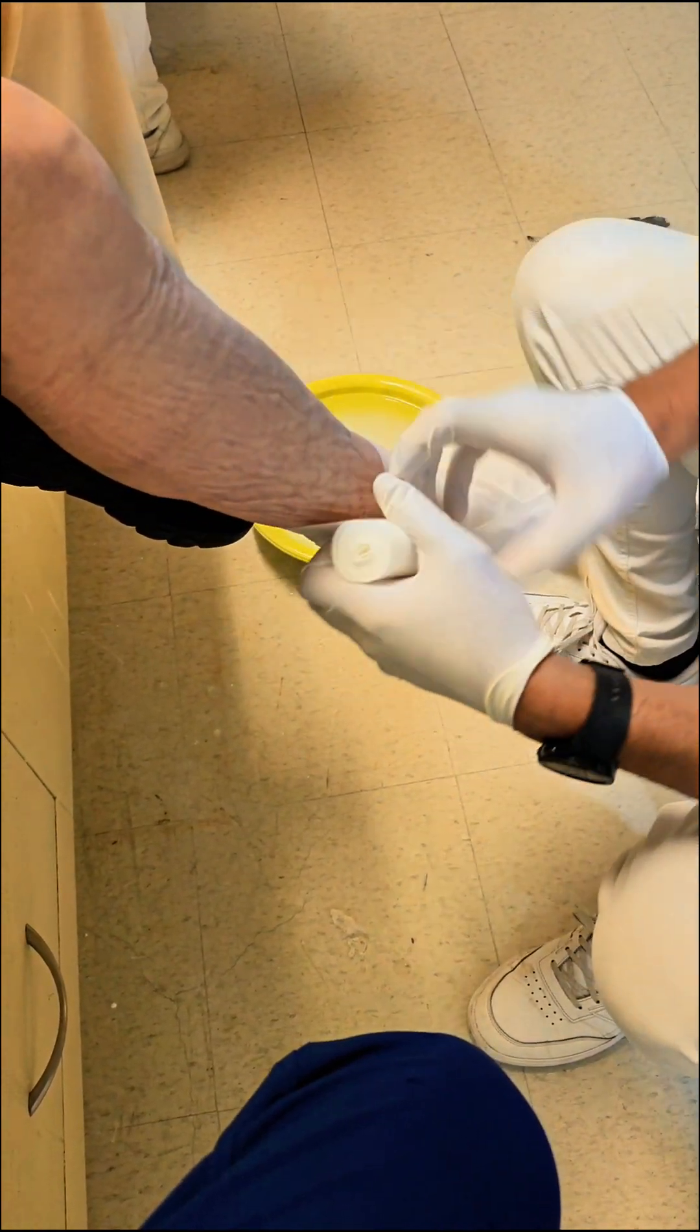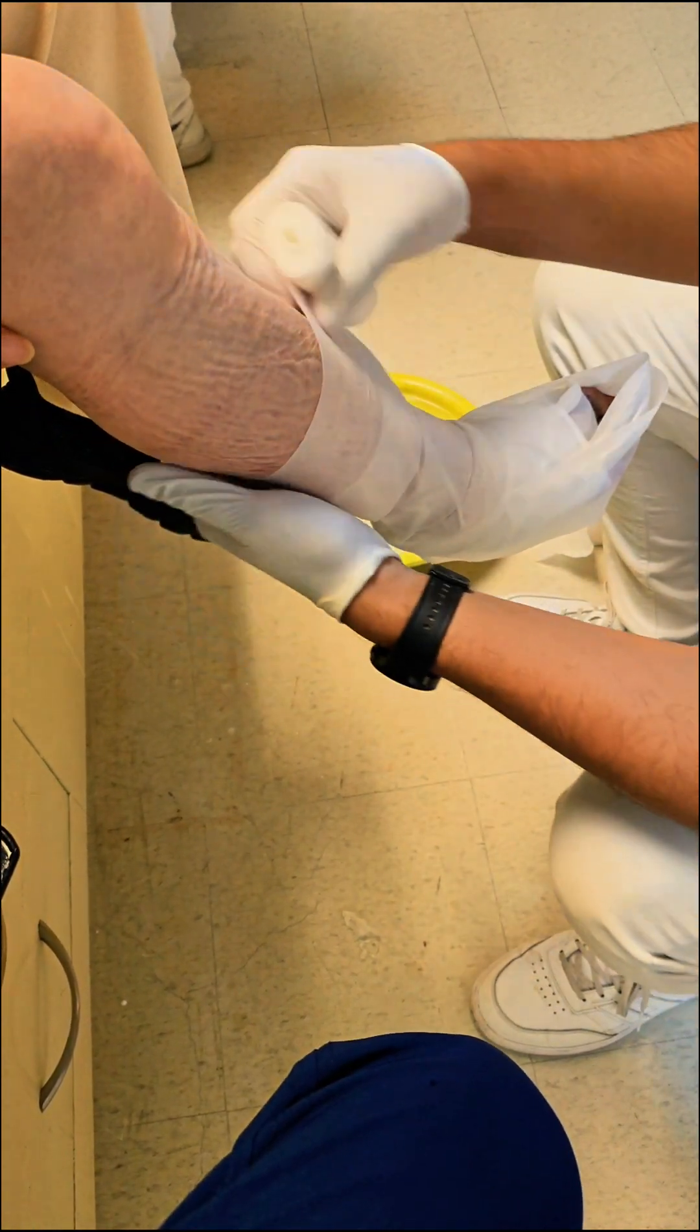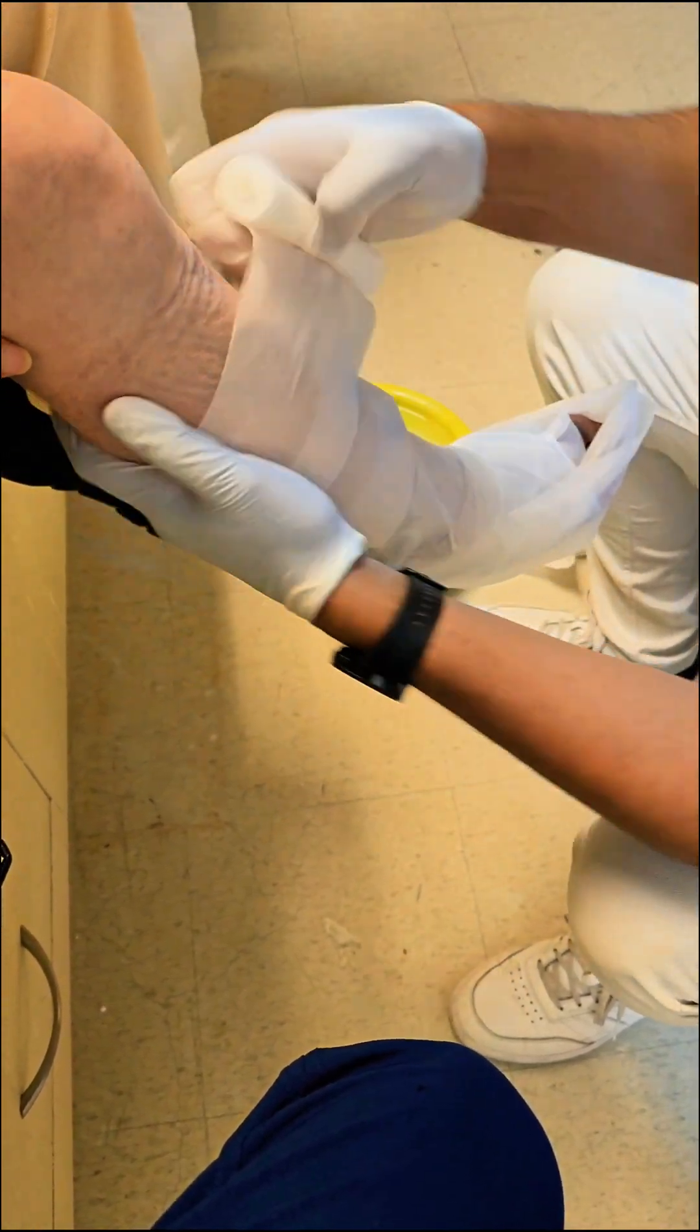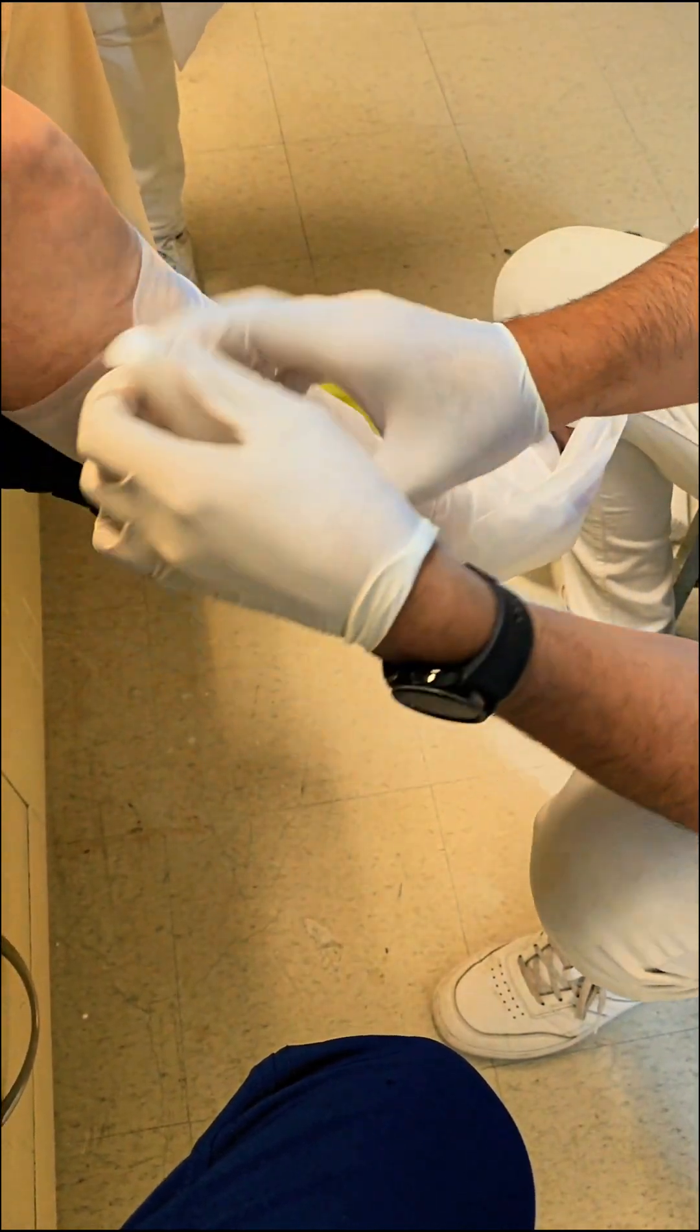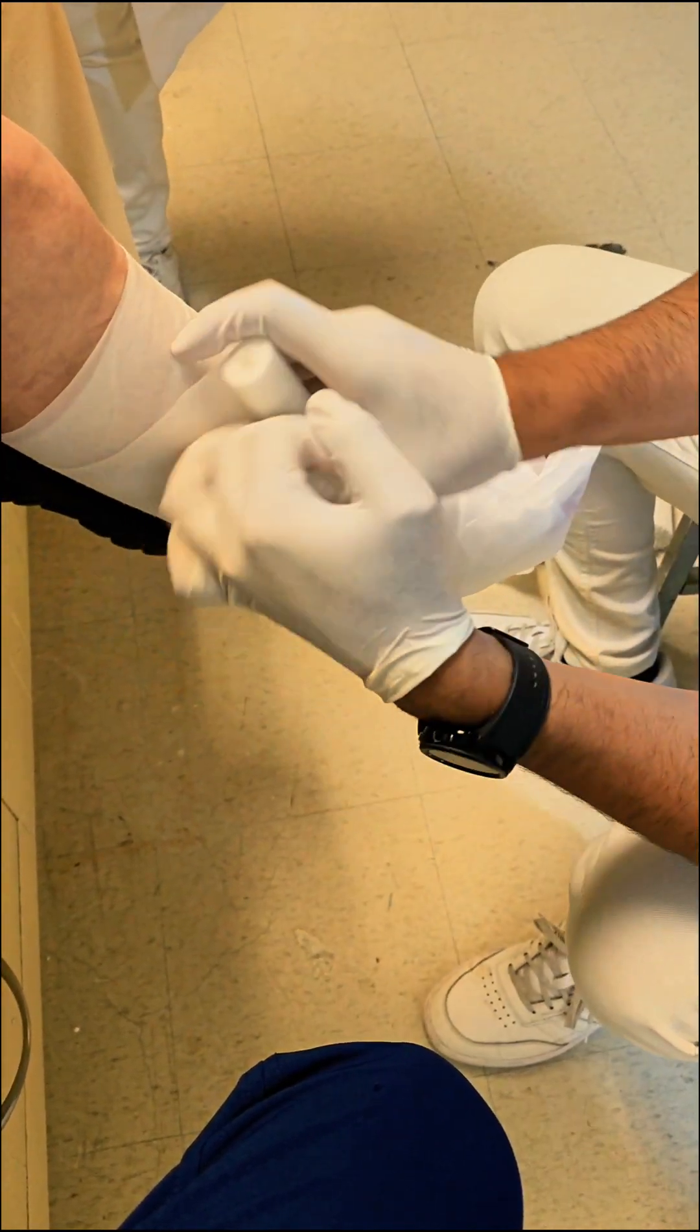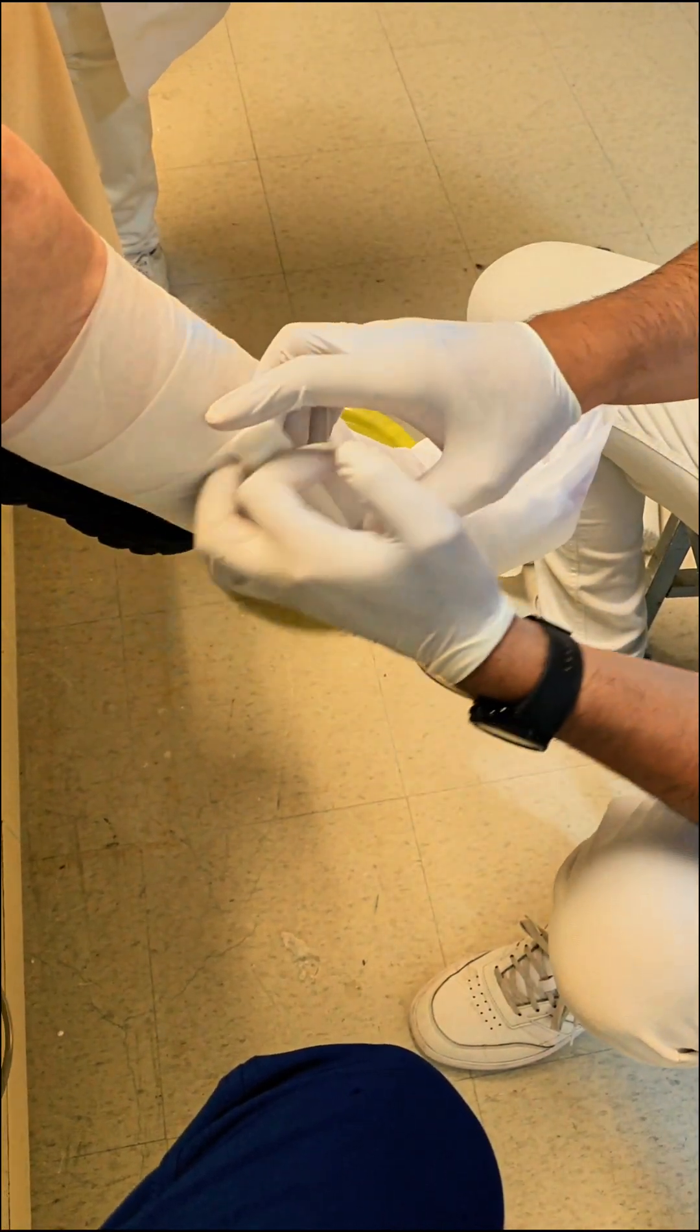Whether you're a healthcare professional looking to refine your skills or just curious about how these unique casts are applied, you're in the right place. Stick around because we're about to break down each step, explain why each method is used, and share some expert tips to make sure the cast fits perfectly every time.